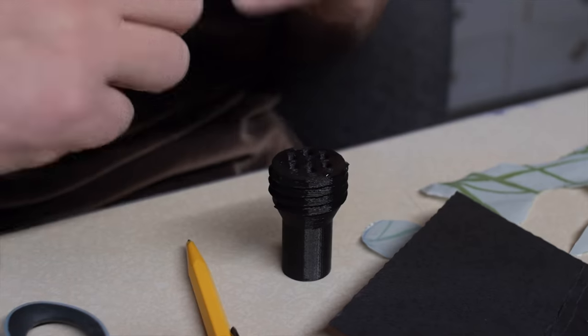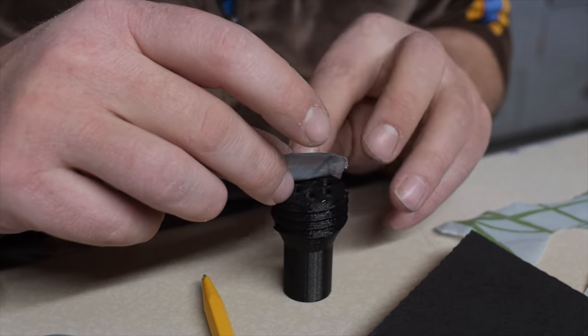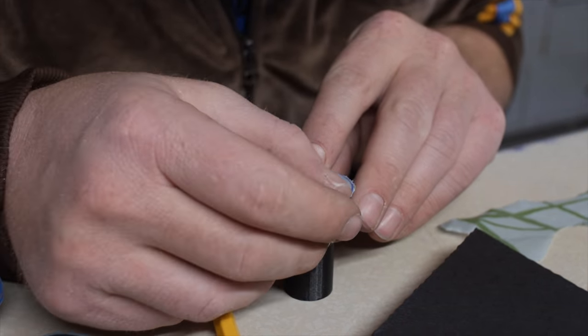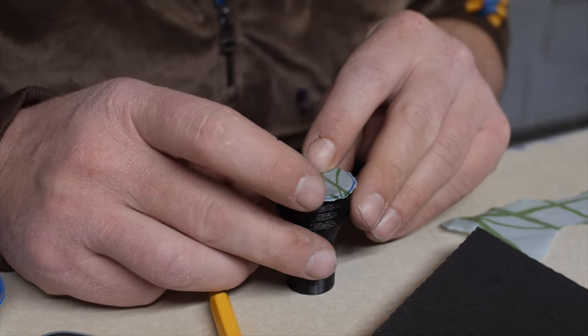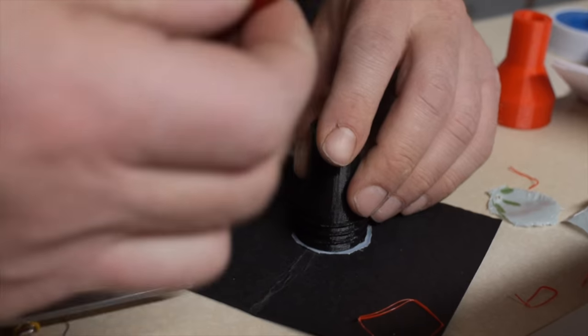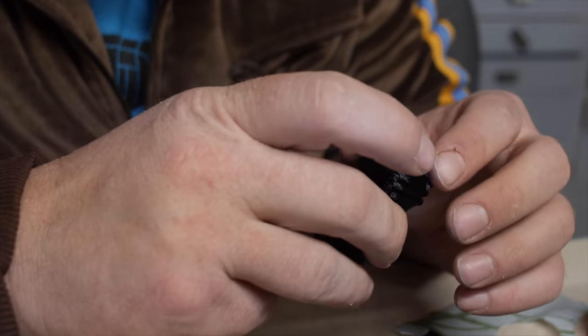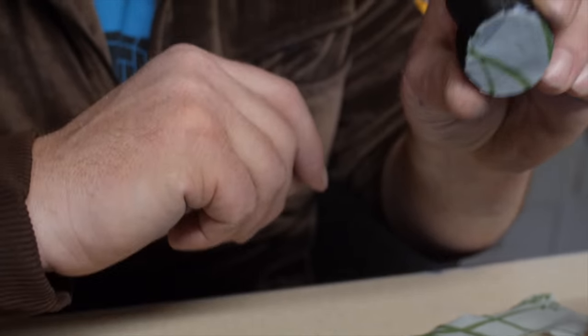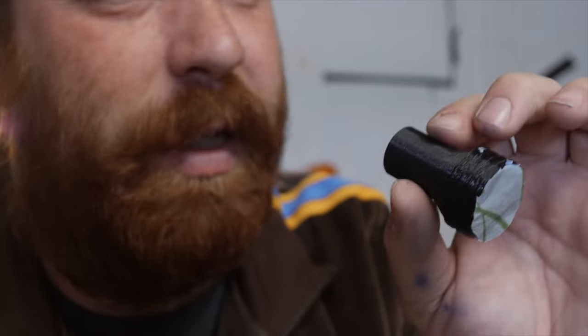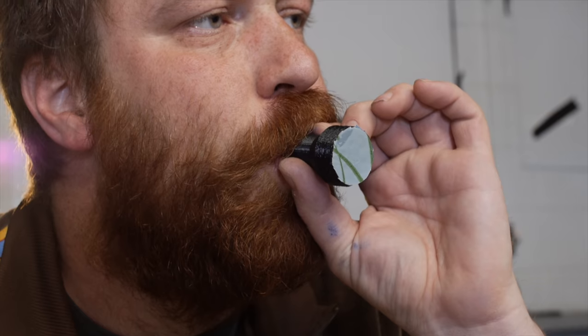I'm just going to glue one side of this plastic bag membrane here. That's a little bit more than I wanted to glue, but okay. Let's let that dry. I'm just going to trim the edges so that it'll fit inside the housing here. I think we could make a cutting guide so that you could cut plastic bags. Inhale some cyanoacrylate, probably not good for me. I think that works.